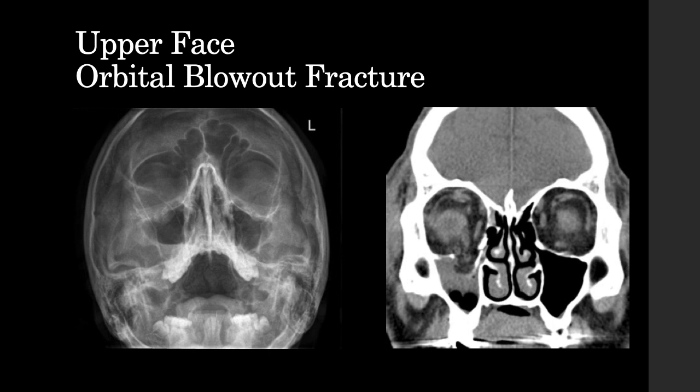So if the tissue isn't trapped, the surgeons will tend to watch and wait and observe these. But in the case of this patient here, the tissue is trapped within the bone, so they'll go for an ORIF, i.e. an open reduction internal fixation. So the surgeons will go in, again, cut through the skin, dissect down, and fix the bone with a plate. You will sense there's a theme with facial fractures, there's a lot of plating.